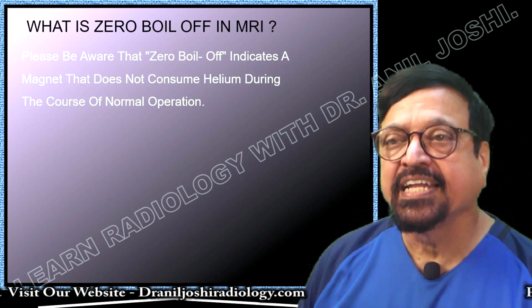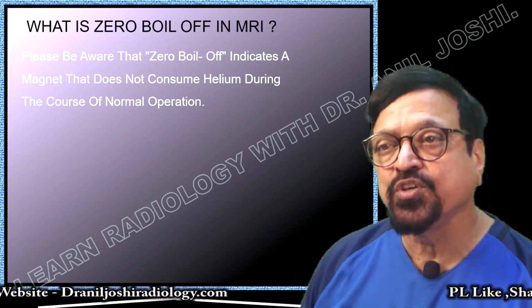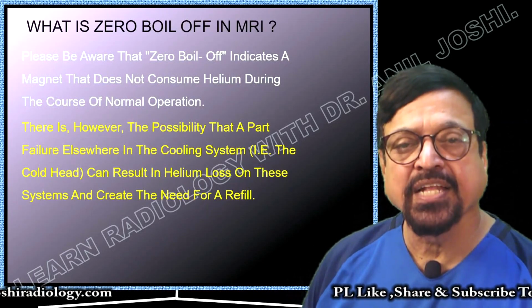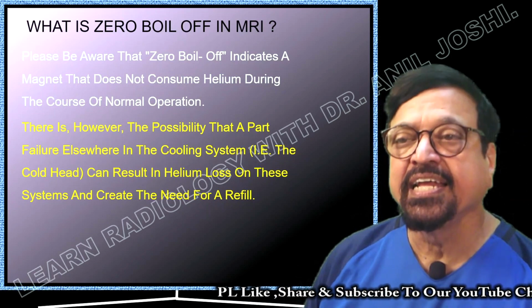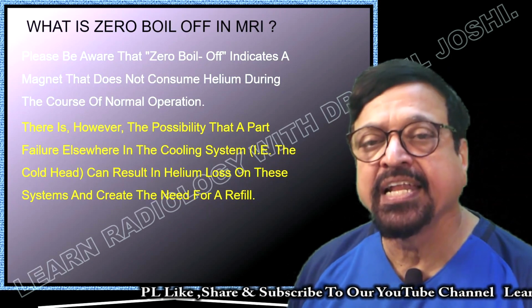Please be aware that zero boil off indicates a magnet that does not consume helium during the course of normal operation. So whatever it receives, it gives back, and during circulation and transmission there are no helium losses. There is, however, a possibility of a part failure elsewhere in the cooling system, that is the cold head. Now please go to my lecture on the cold head.